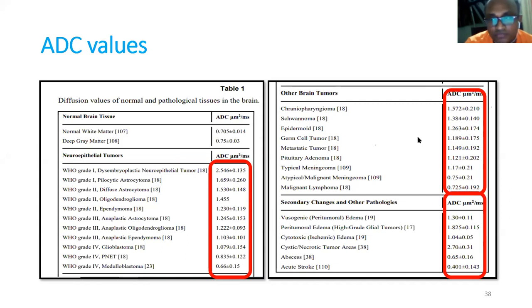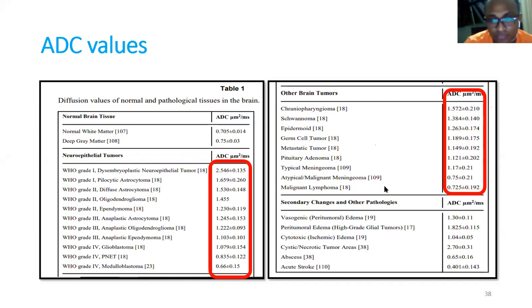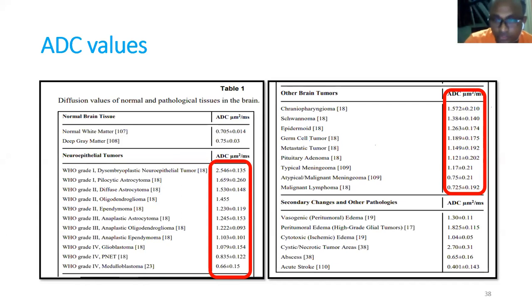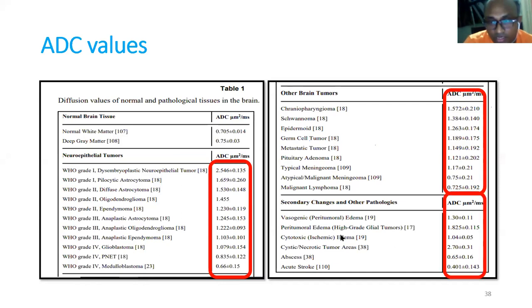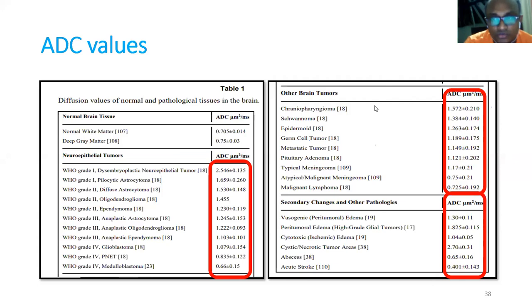Looking at other brain tumors: craniopharyngioma has a higher ADC value, while malignant glioma has a very low ADC value. Low ADC means higher restriction of fluid diffusion and more malignant. Conversely, peritumoral edema has very high ADC. Acute stroke has low ADC. These distinctions help in characterizing pathology.